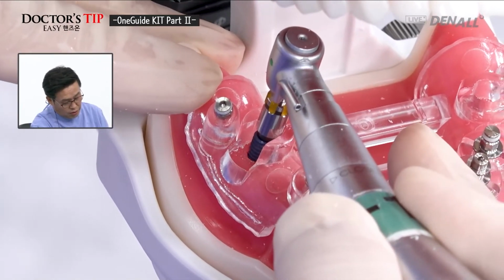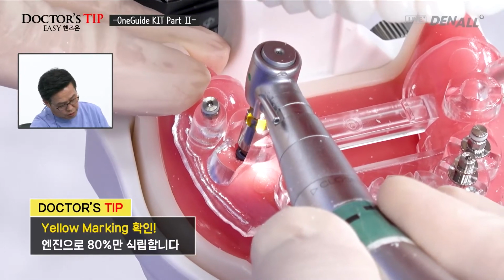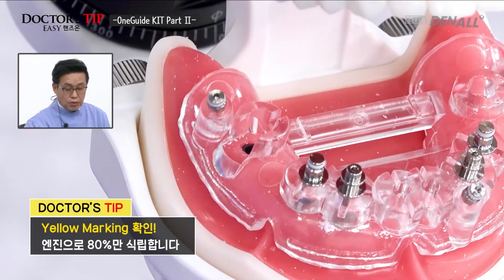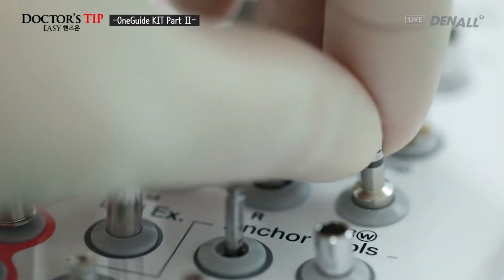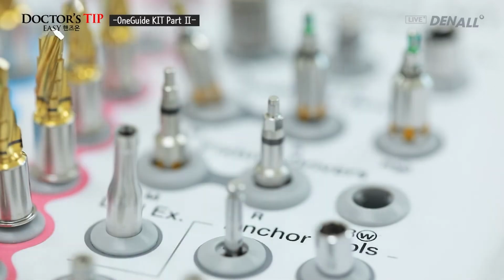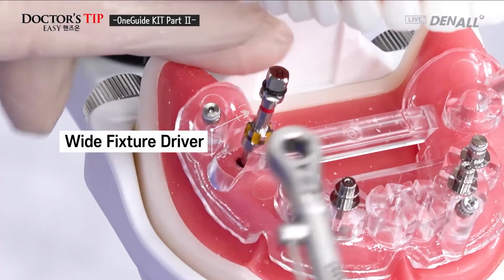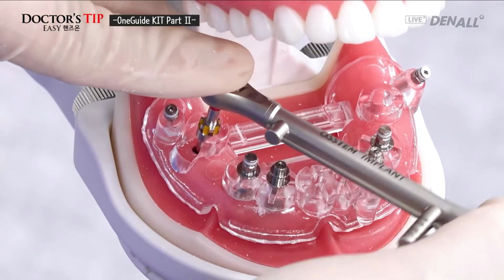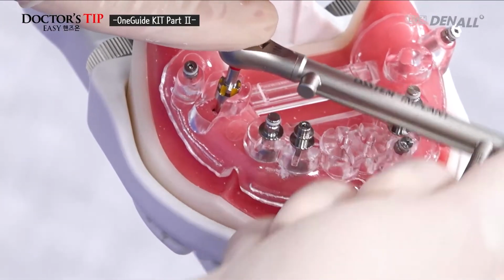5.0 by 8.5 millimeter fixture is chosen. Because this is open type, you need to make a contact, and fixture is going to be placed approximately 80% and then remove. On the fixture driver, wide type, wide hole fixture driver is chosen. Check whether it's well connected. Hand wrench is going to be used to check the final position.